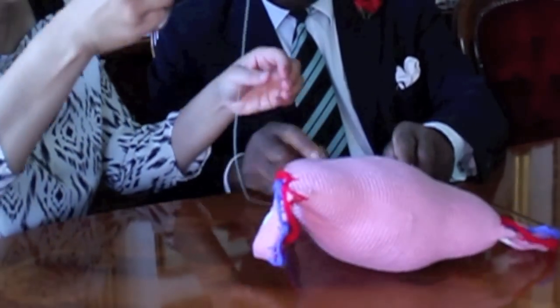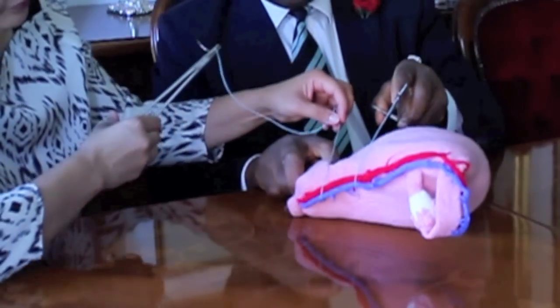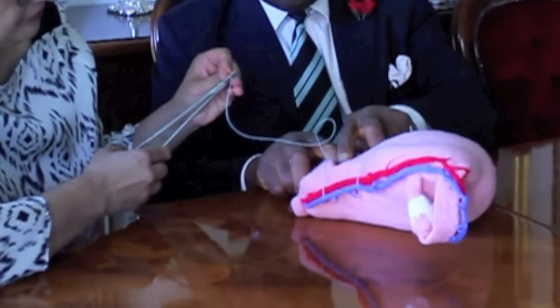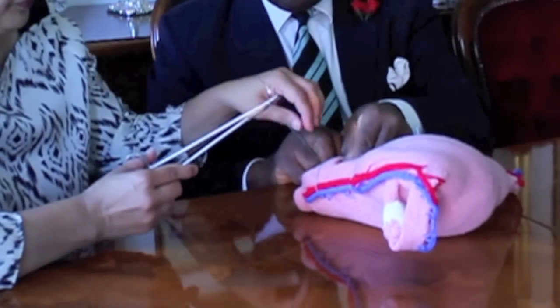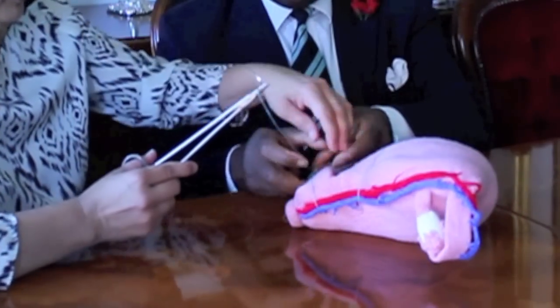By doing that, you will see from this demonstration that this suture will occlude the upper vascular system that supplies the lower segment. And this one will occlude the lower, which anastomoses with that upper vascular pattern.